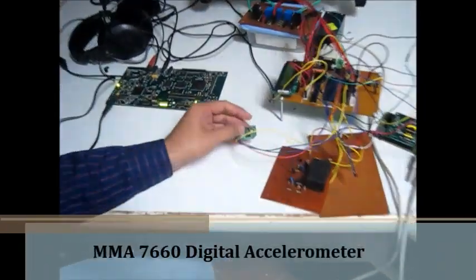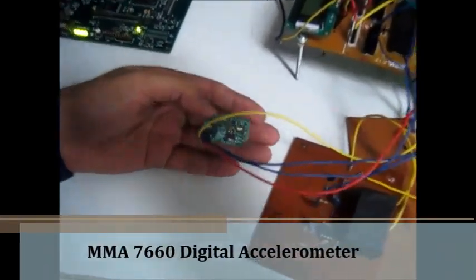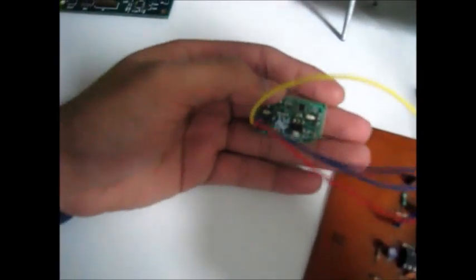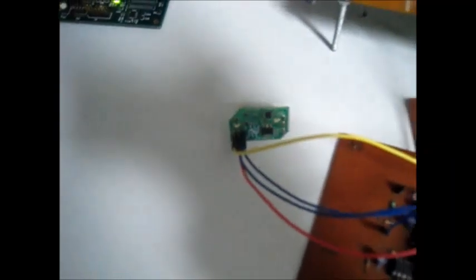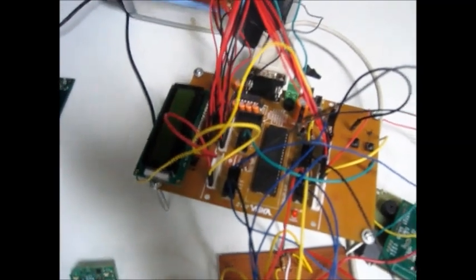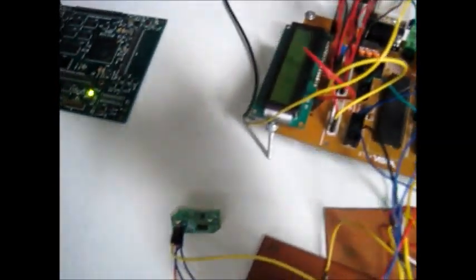The acceleration sensor used is the MMA7660 digital acceleration sensor provided by Freescale Semiconductors. It uses the I2C protocol to communicate with the microcontroller. The accelerometer is interfaced with the ATmega16 microcontroller. Depending on the orientation of the accelerometer, different values are generated in its tilt register. Based on these values, we have programmed the MCU to drive the motors.